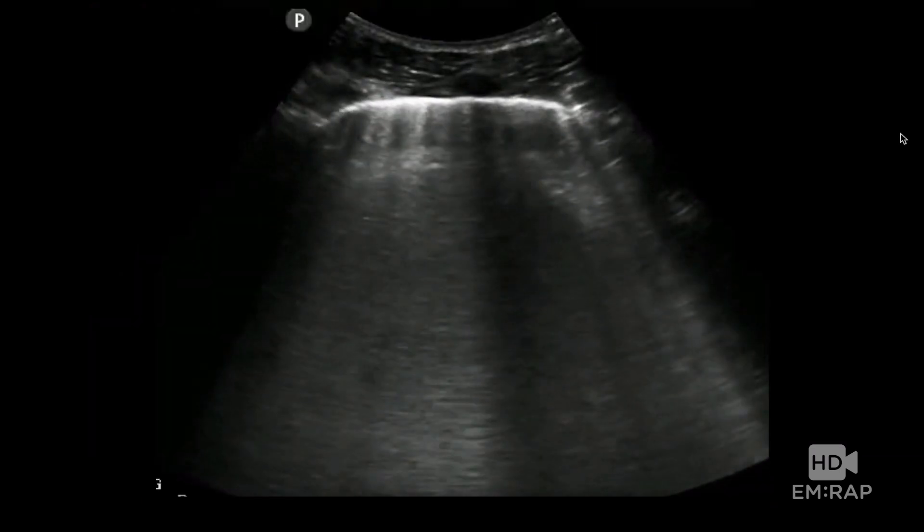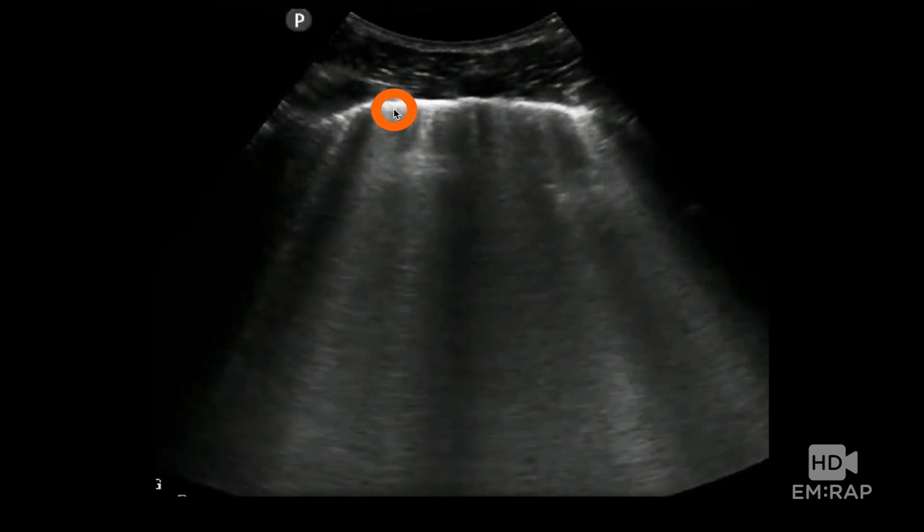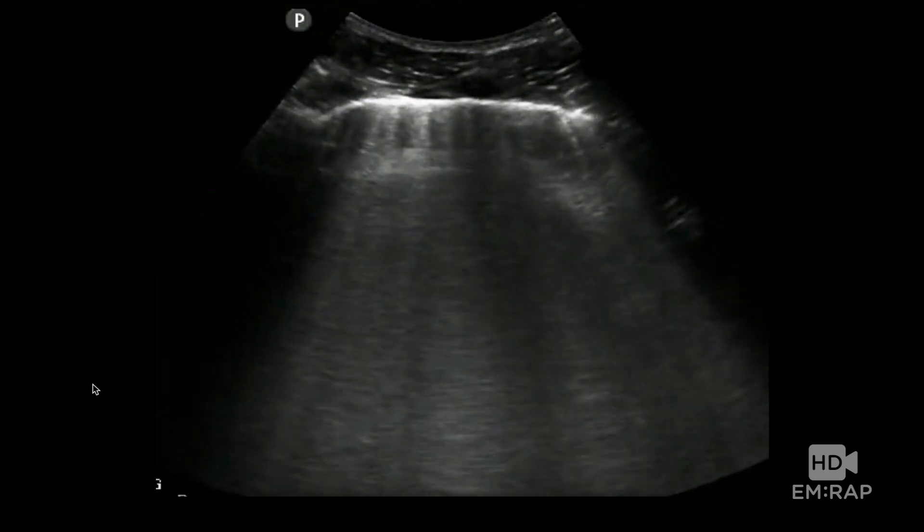So these are B-lines. So this is the pleural line right here, and you can see these vertical artifacts starting from the pleural line extending all the way down. This implies that the patient has pulmonary edema.